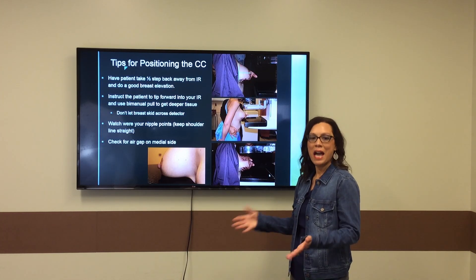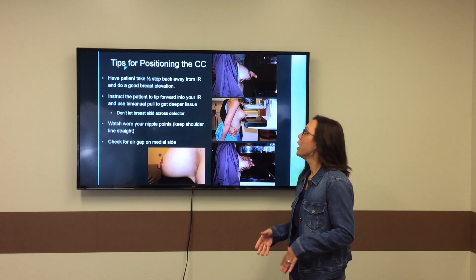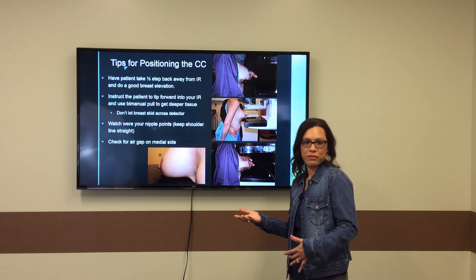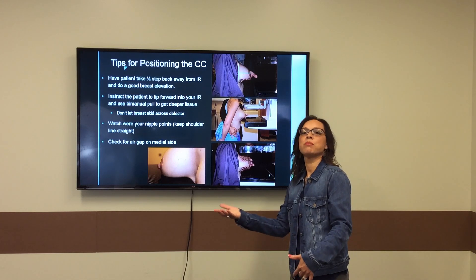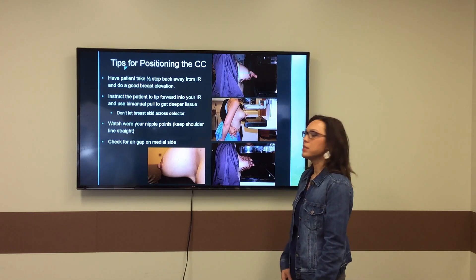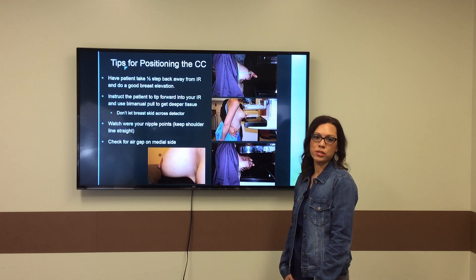And then, with the patient about a half a step away from your machine, I like to physically guide her if I can by wrapping my arms all the way around her and really ask her to tip forward into the mammography machine, sticking her bottom out and leaning her chest forward.